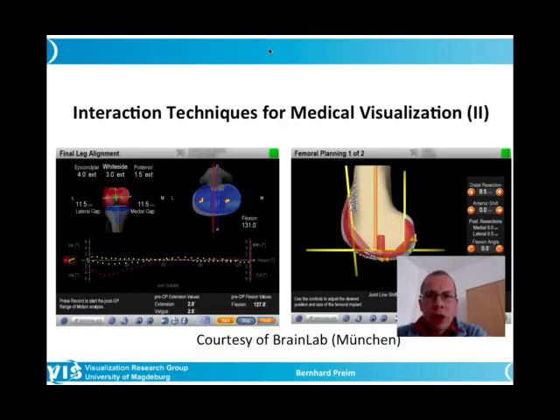We discuss today another round of interaction techniques for medical visualization. Visualization here really means that we do not only generate nice images, but that we want to support an exploration process, an interactive process that leads to additional information about the patient data.